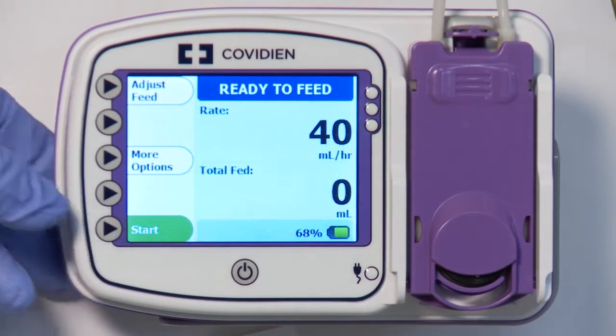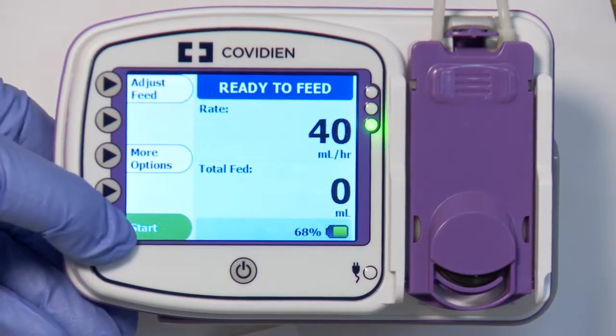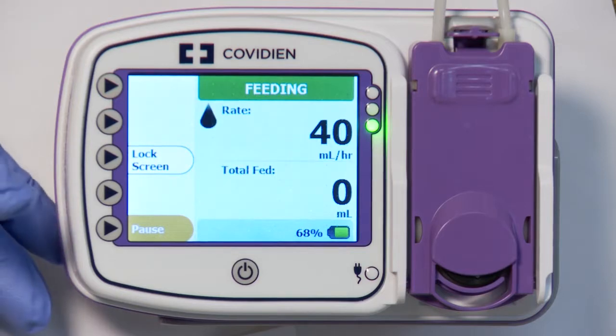The screen should now say Ready to Feed. Confirm the rate shown matches the rate prescribed. Once confirmed, press the Start button to begin feeding. Once started, you must press the Pause button to change settings.